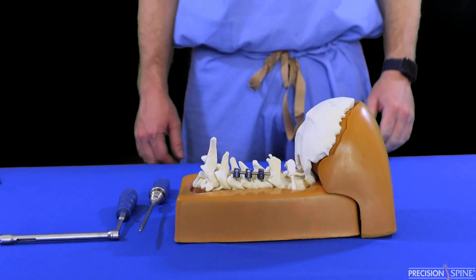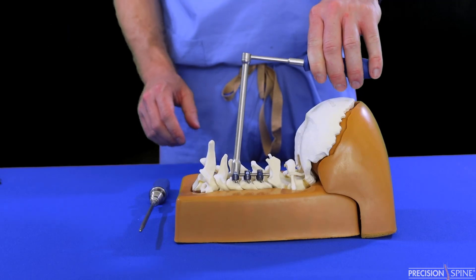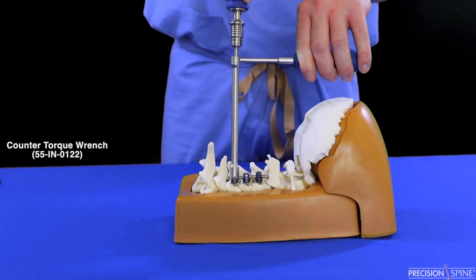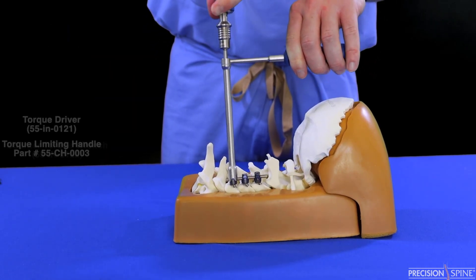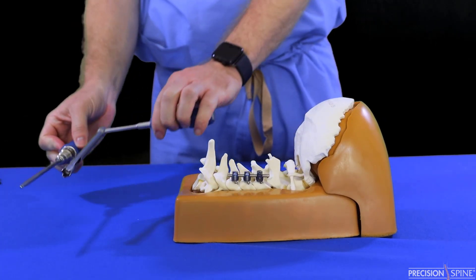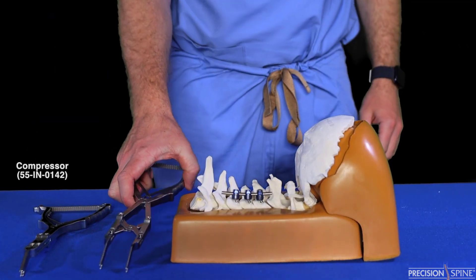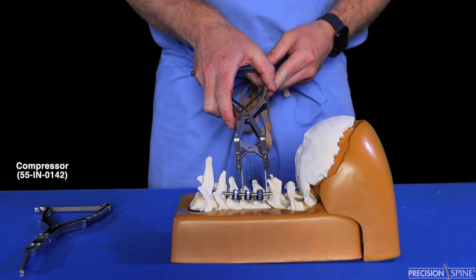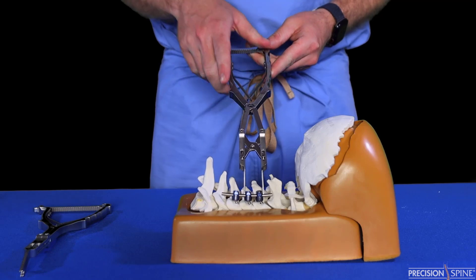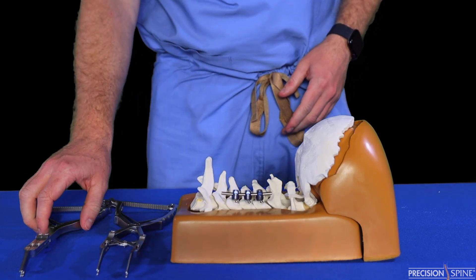Step 4: Final tightening. Final tighten each cap screw by assembling the counter torque wrench to the desired polyaxial screw and insert the torque driver through the torque wrench barrel. Rotate the torque driver until a clicking is heard, indicating 27 inch pounds. The compressor is utilized by straddling the two tulips you want compressed — one should be final tightened and the other loose. Once the desired compression is achieved, final tighten the loose set screw.